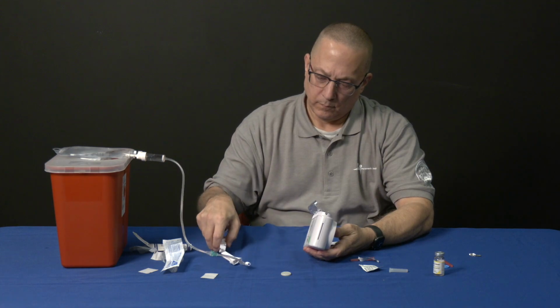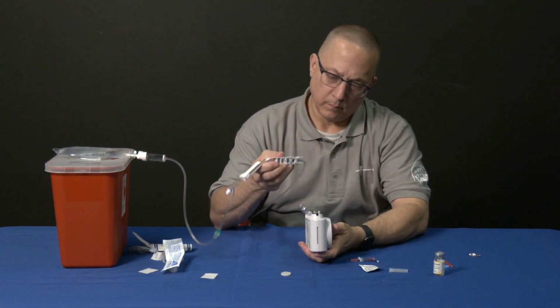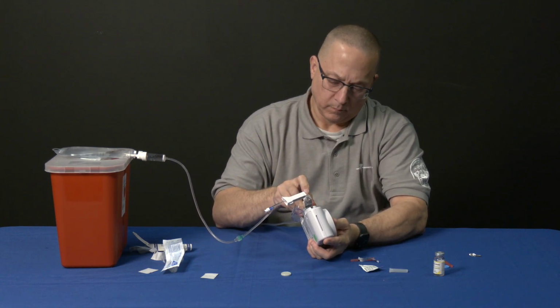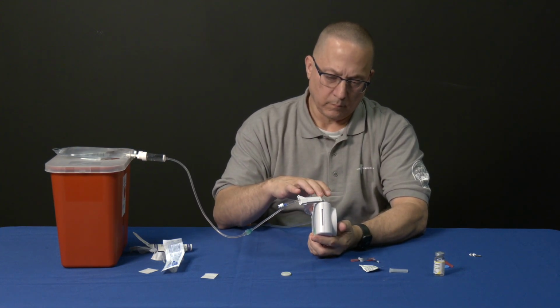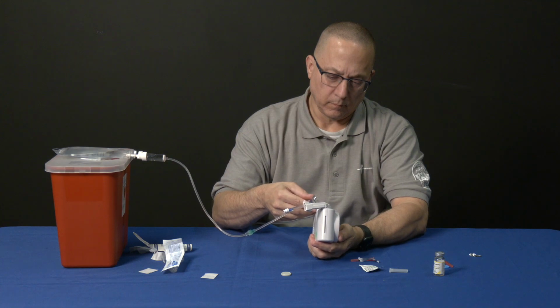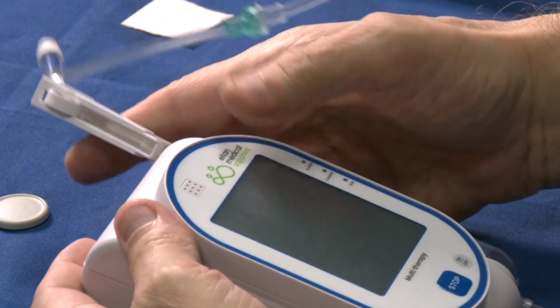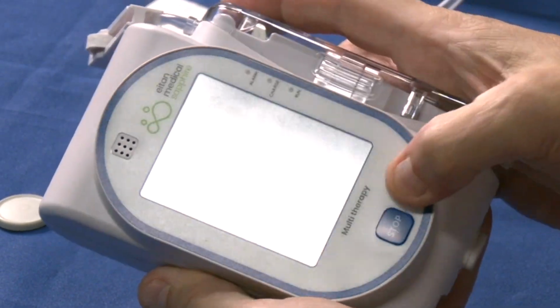Next, we will install the cassette into the chamber. Place the forks on the bottom of the cassette into the pins and pivot the top side of the cassette into the pump. You will hear an audible click when the cassette is properly attached to the pump. Close the cassette door. It will latch shut. Tap the on-off button. The pump will run through a brief warm-up and self-test.